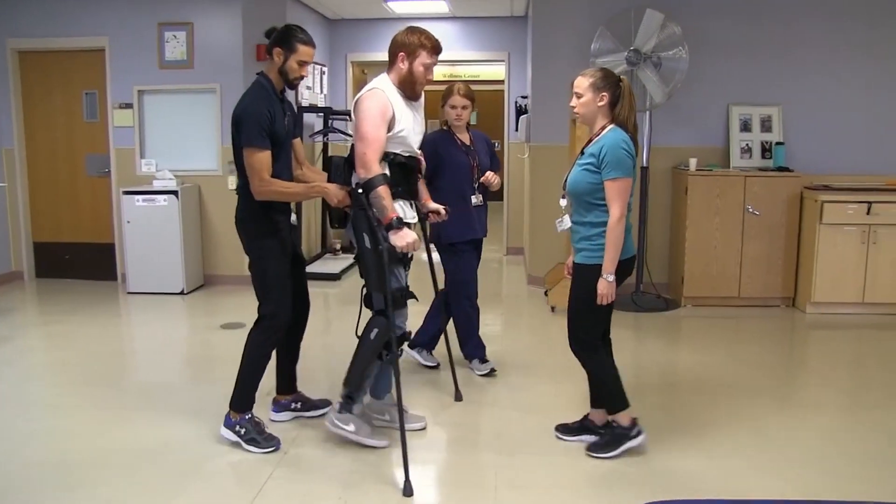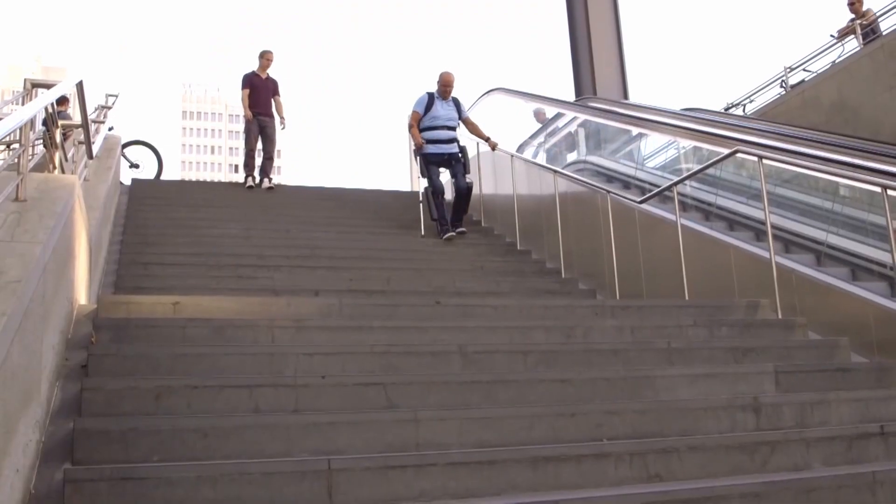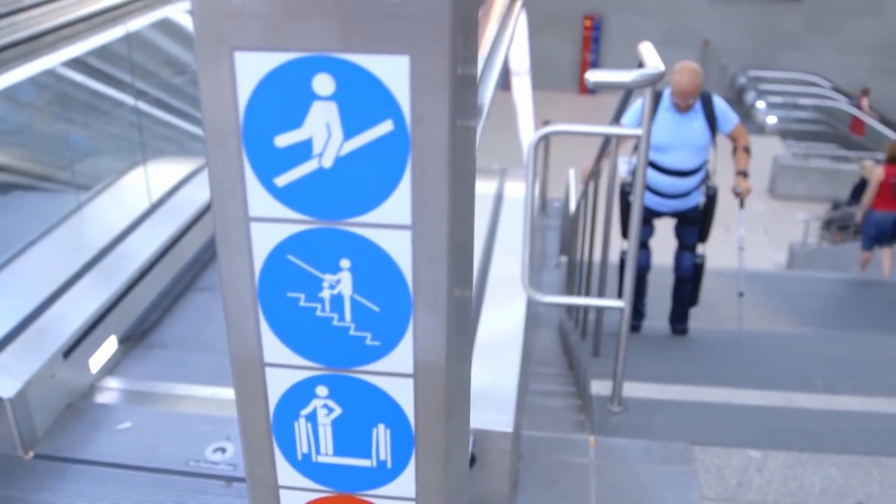For each command, the exoskeleton executes a set of specific movements. This solution works pretty well, and exoskeletons like the ReWalk are already available commercially. But what if we want a sleeker solution — what if we don't even want to press buttons?